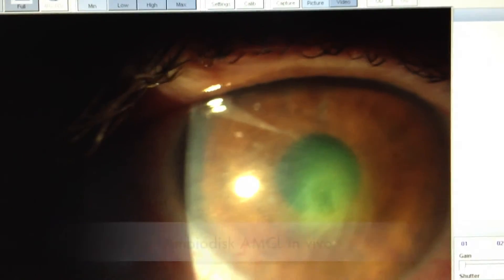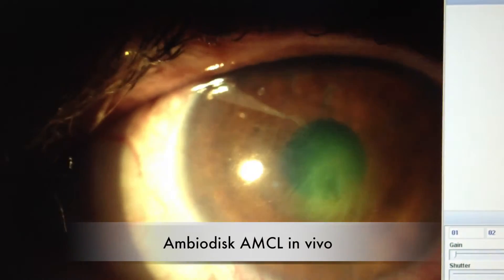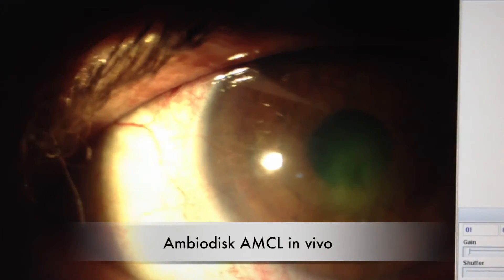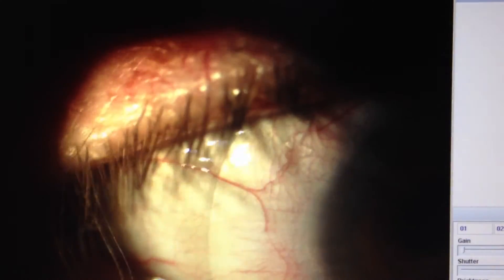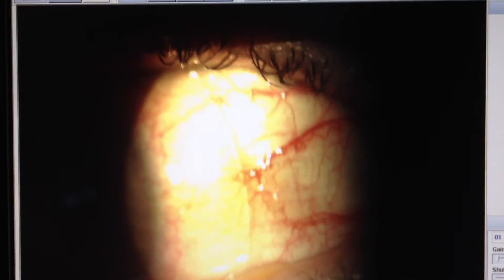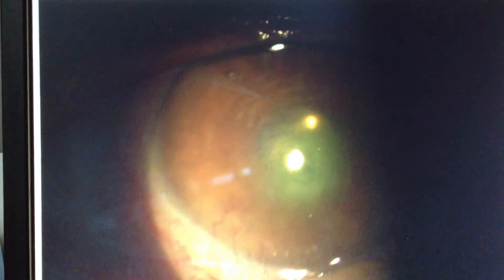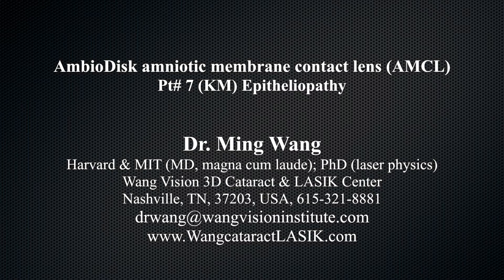These dehydrated amniomembranes are manufactured in such a way that the membrane stays with the contact lens. This is a recurrent corneal ulcer, non-healing with traditional therapy, shown with amniomembrane contact lens in vivo in the eye right after placement. In a study of over 100 amniomembrane contact lens patients to be presented at the American Society of Cataract and Refractive Surgery Meeting 2014, we found that the success rate for treating and successfully closing non-healing corneal ulcers is about 85%.